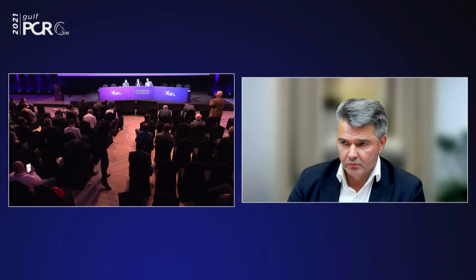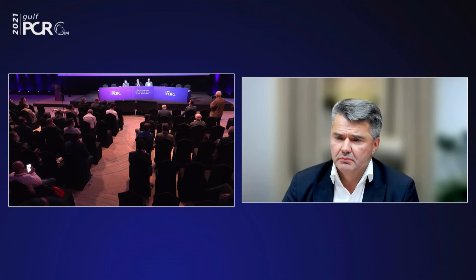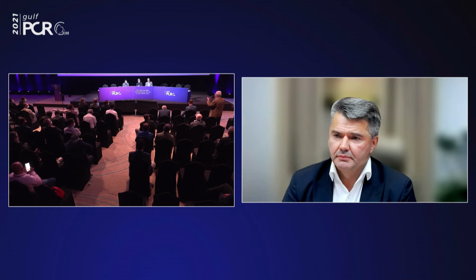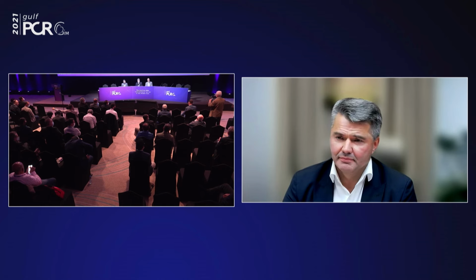You know, I work in a very poor setting, and I've learned a lot. I'd like to very quickly share what we do, because we don't have any of those equipment except IVUS. So we actually plan our procedure really well, because you know the Mike Tyson quote: everybody has a good plan till you get knocked out in your face and then your plan disappears. So if you cause an edge dissection or something like that, all your plans are going to disappear. So we plan our procedure really well in those patients. We should do that for every patient, but we don't.